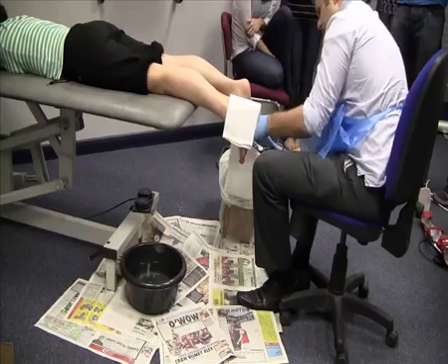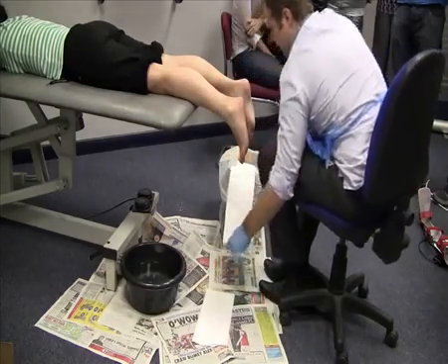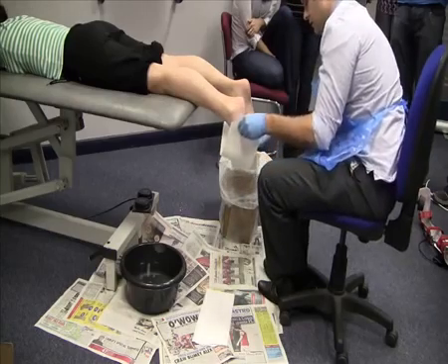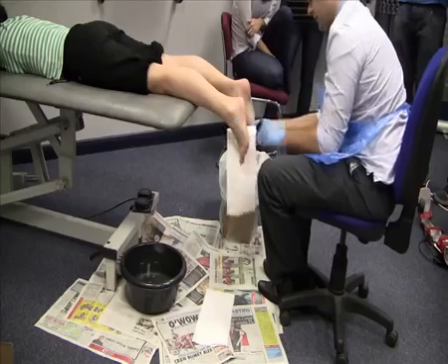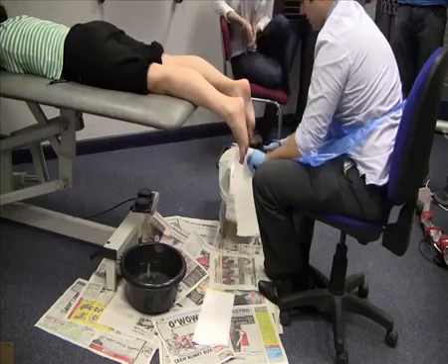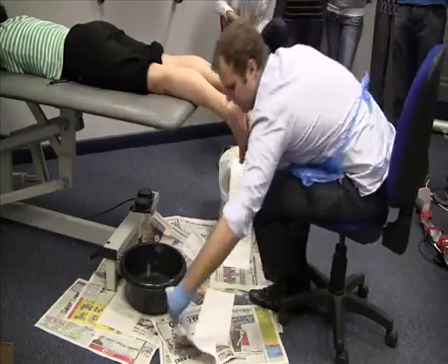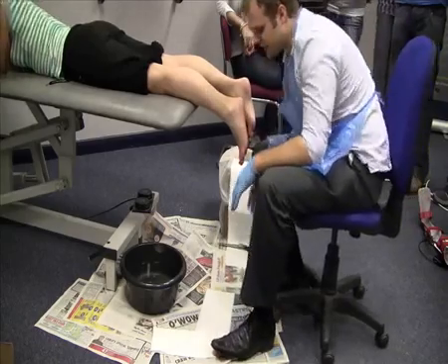Cut your strip off. Get that ready. And then mid-arch to styloid process. And cut your piece off. Put it to one side just in case you drip over it. Start with the top piece.